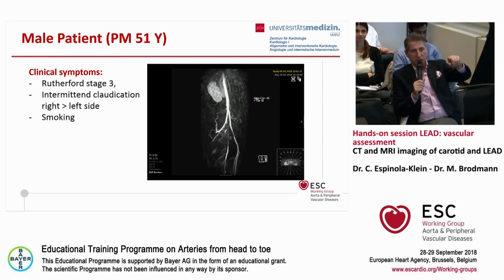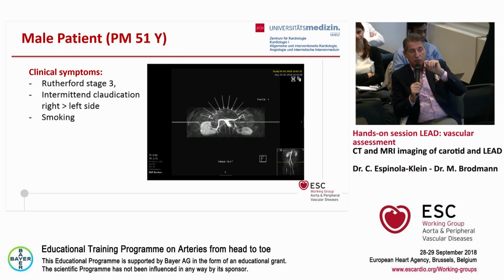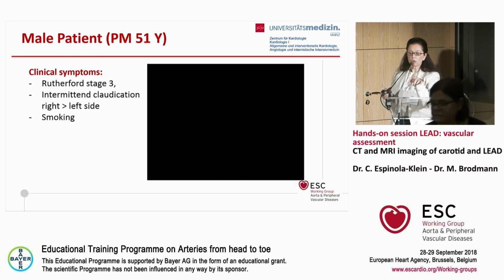A comment about revascularization. At least in my area, surgeons do not perform a bypass in a patient like this without first trying to revascularize endovascularly. At least in my area. Okay, but we discussed exactly this point with our surgeons.